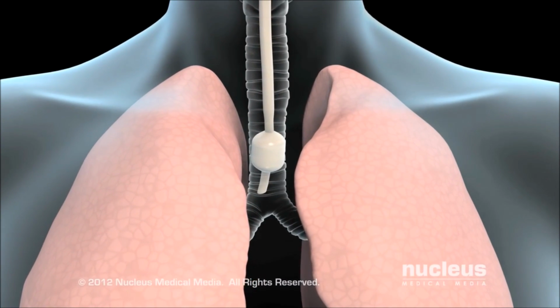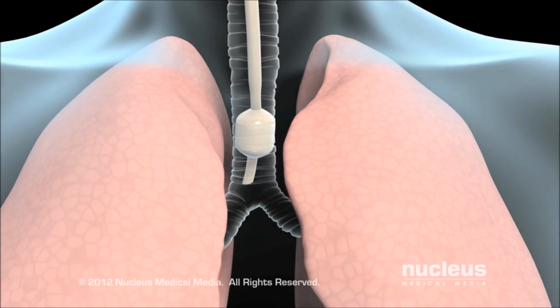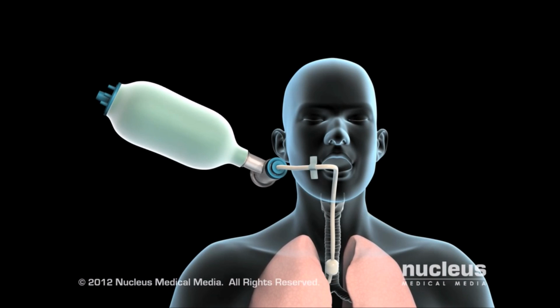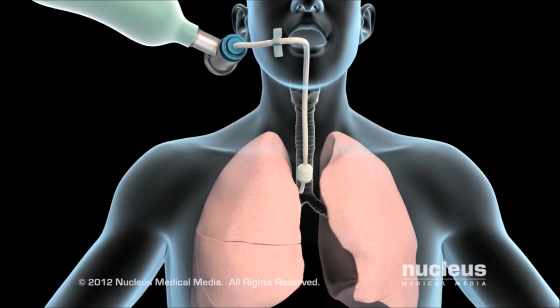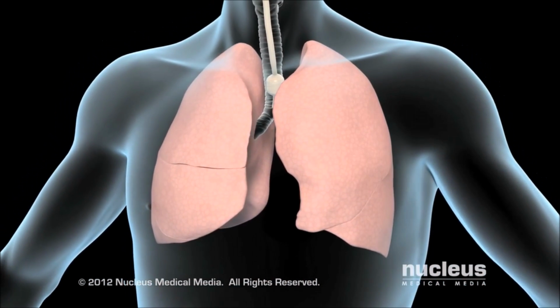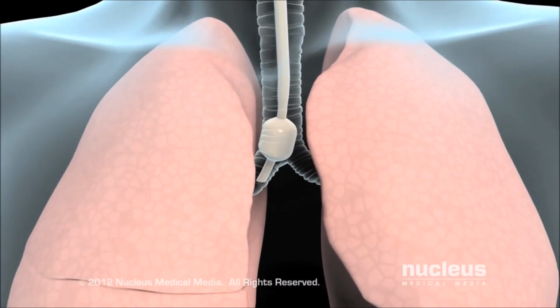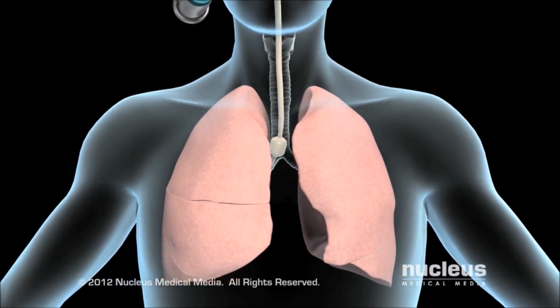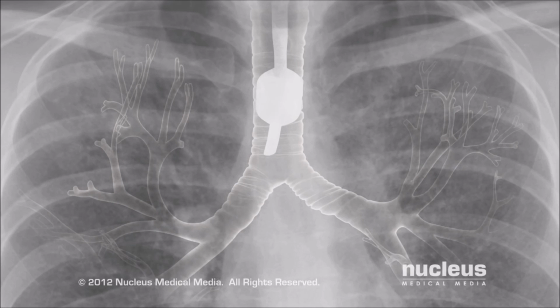Your doctor will check to see that the tube is properly positioned in the lower part of the trachea by inflating your lungs with a special bag and listening for breath sounds on both sides of your chest. If the end of the tube is too low, both lungs will not receive the same amount of air. In some cases, an X-ray is taken immediately after intubation to confirm the tube's placement.